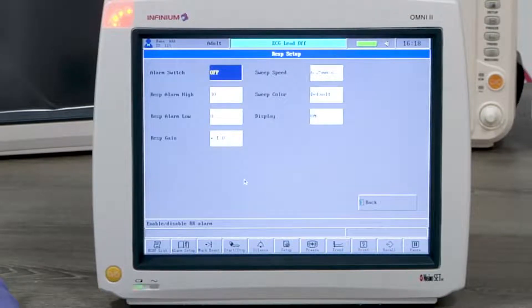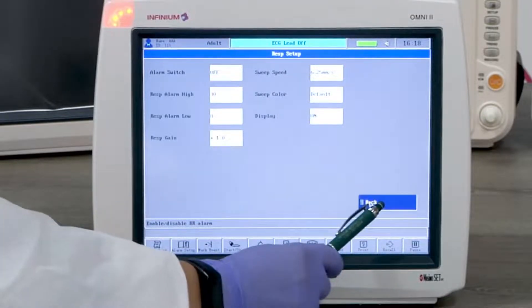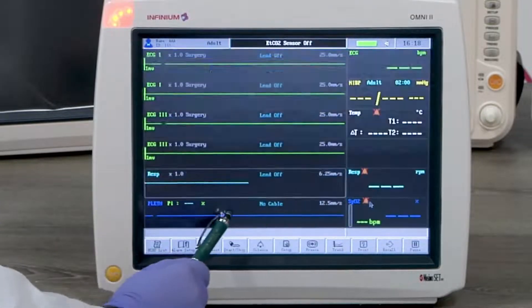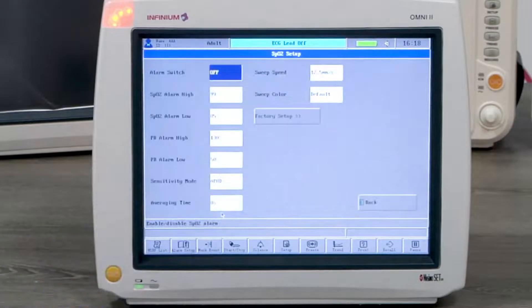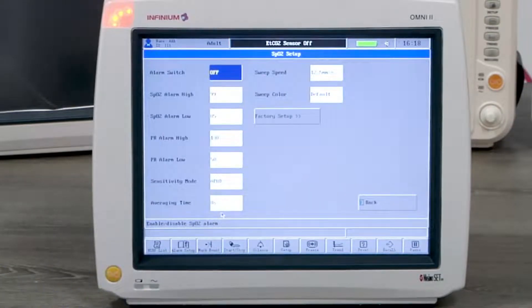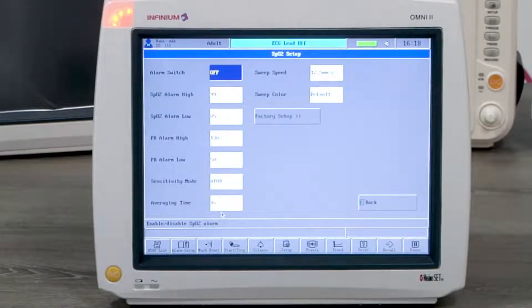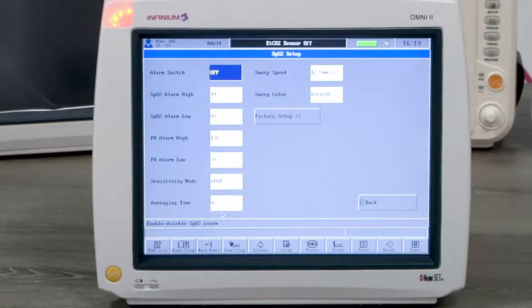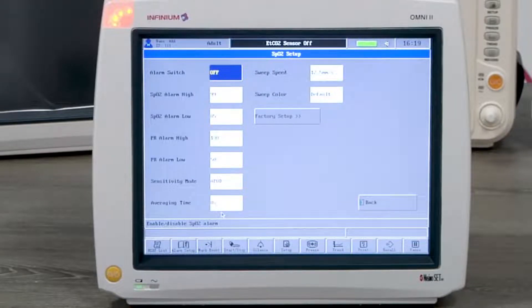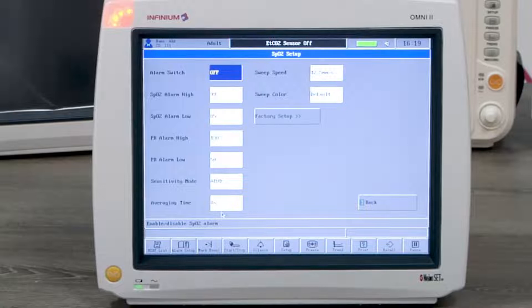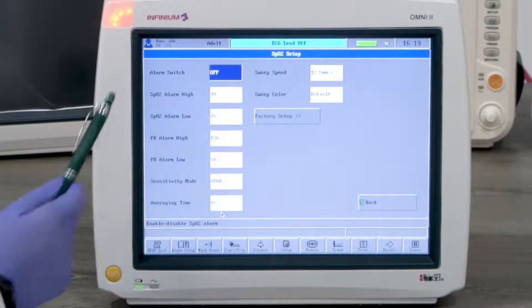Now let's look at SPO2 monitoring. Tapping on SPO2 reading or pleth waveform window will enter the SPO2 setup menu. The setting can be changed according to the user's preference. Sensitivity mode and averaging time are only available if Massimo SPO2 is installed.